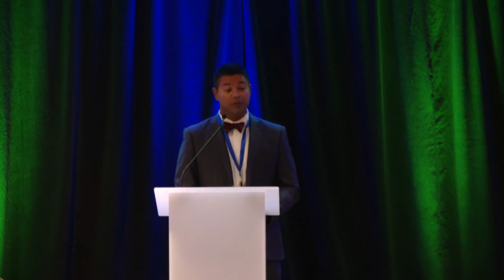With manometry, these different pressures are assigned colors, and the idea is that warmer colors, our reds, our purples, are assigned higher pressures. And so when we have a high-resolution manometry catheter with all those nice closely spaced sensors, each of those is measuring these pressures that change with esophageal muscle contraction over time. These are assigned their colors.